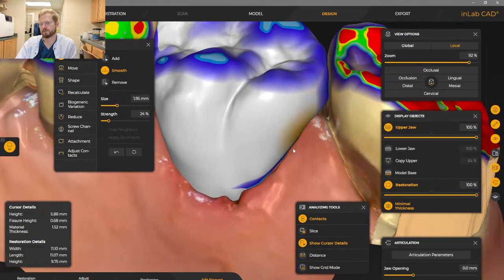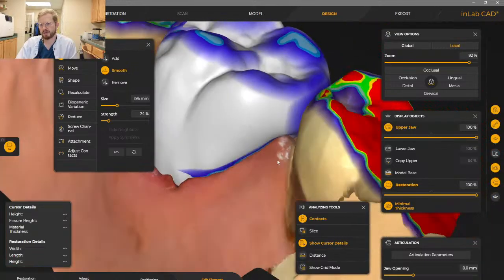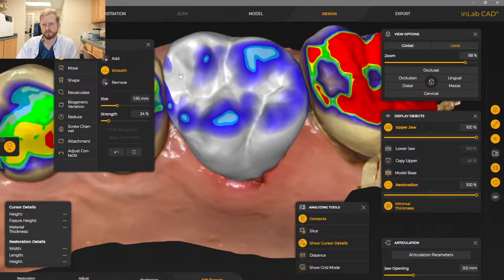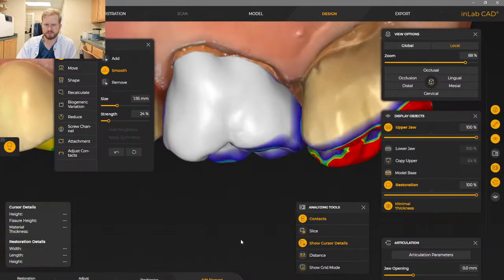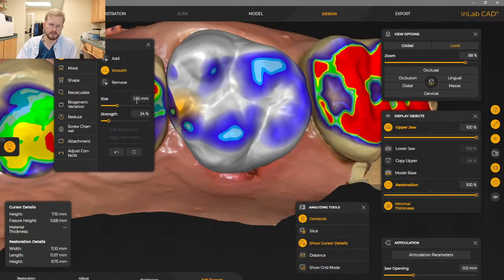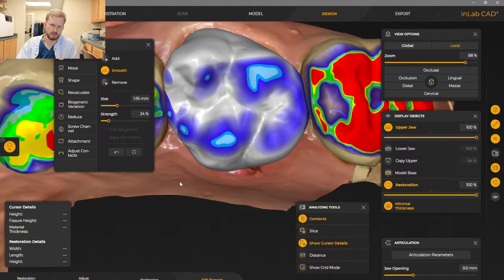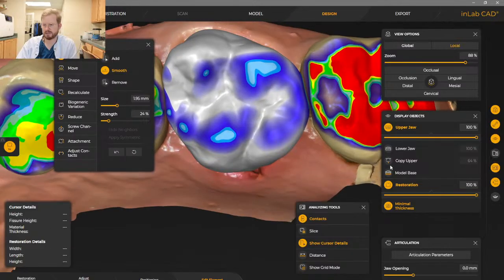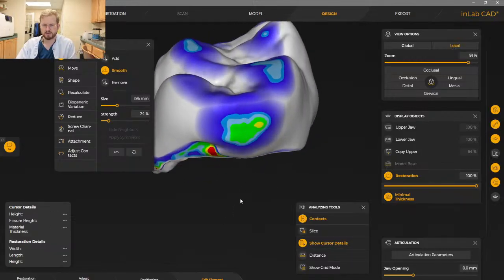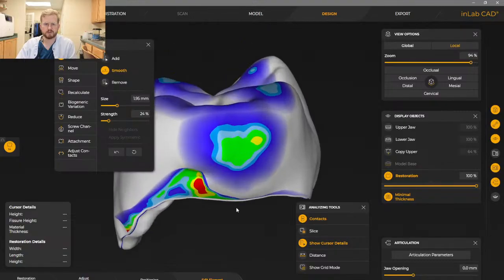I moved a little bit off that distal marginal ridge. I didn't want it to have a belly or a bump on it, so I just made it flat. I'm okay with that. We've got enough occlusion on this too where she can chew it, but first C's contour looks maybe a little bulky in the proximal contacts. We're going to just remove the other T, and we'll go straight to the last C, which is contacts. It's not terrible, but it does need some fixing.